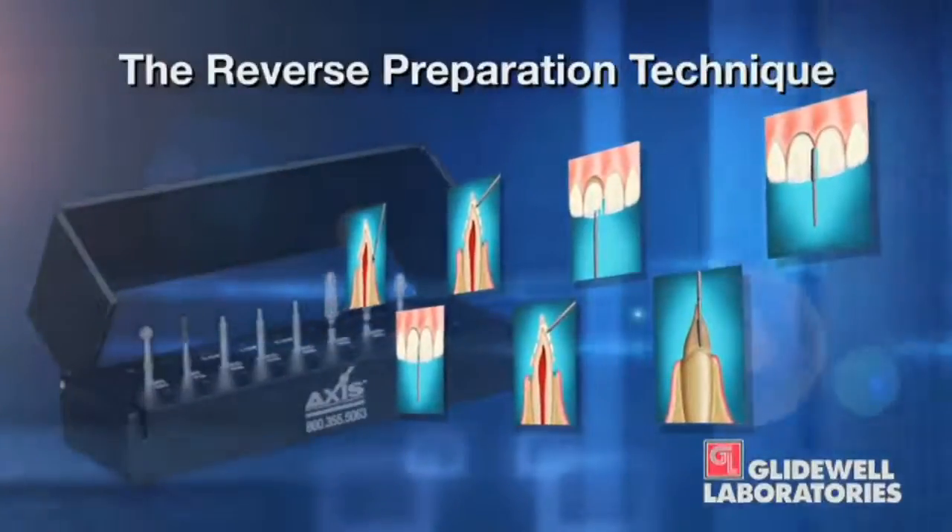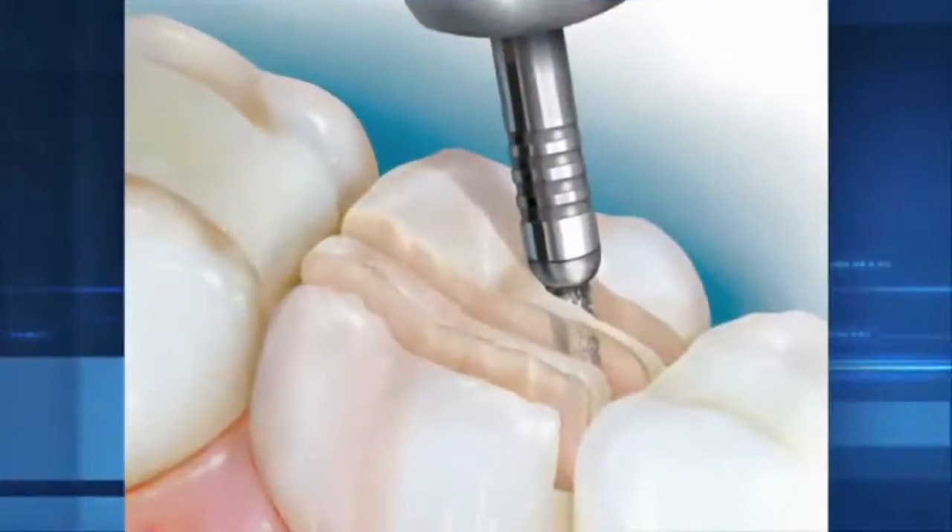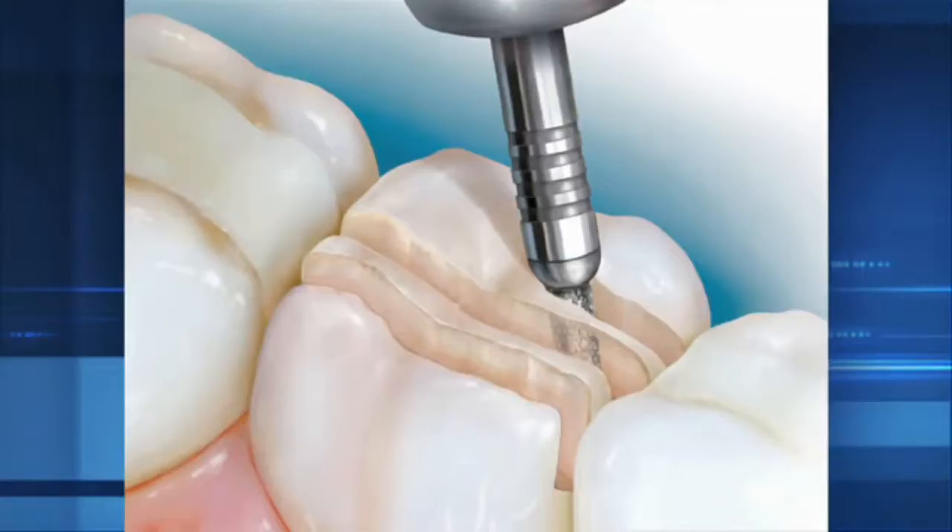Looking back at the first 13 or 14 years that I practiced dentistry, I have to conclude that I was a chronic underprepper. When you see this technique, we'll look at the burr kit — we have a way of using depth cuts. It's a depth cut based technique. One of the depth cuts you place is a 2mm depth cut in the occlusal surface — the same 2mm that practically every dental material manufacturer has been asking for. And I never gave it to the laboratory. When I started doing this prep technique, I would place a 2mm depth cut in the occlusal surface, prep until I thought I was done, and invariably I still had half of that depth cut left — so I'd only prepped about a millimeter.